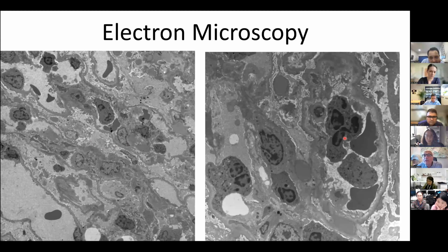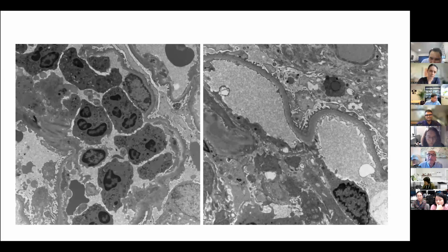On higher magnification, we can recognize these neutrophils again. And there is also some other material I'm not sure about here. It looks a little bit paler than in the actual PowerPoint. So pay attention to this region and to this region. We see some round stuff, and we'll see a better view of those things in the next couple of slides.